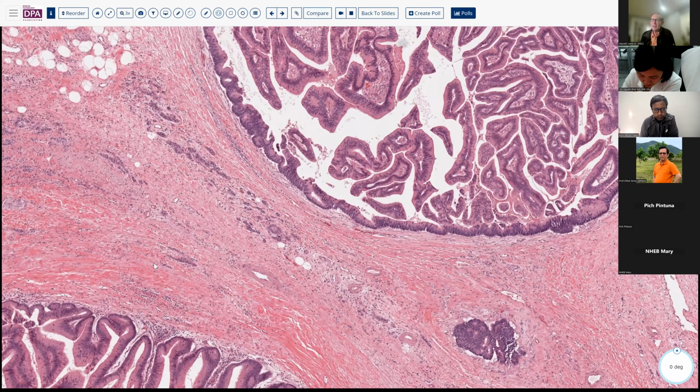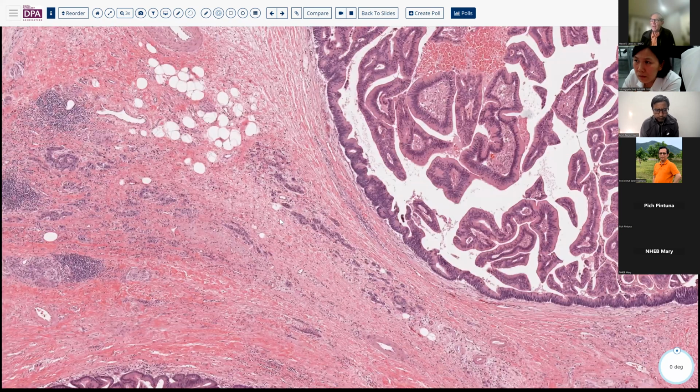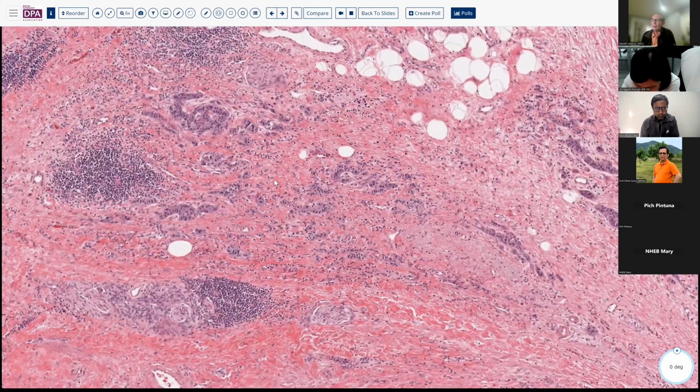Now, that can sometimes be a difficult question because as these lesions expand, they compress the residual pancreatic epithelium, and the acini degenerate and involute, or disappear essentially, leaving just the small ductal elements, which can look very much like an invasive tumor at times. Usually you like to see a little bit of lobular architecture, but this inflammatory process also helps you.